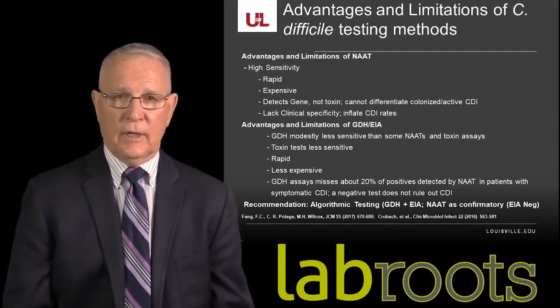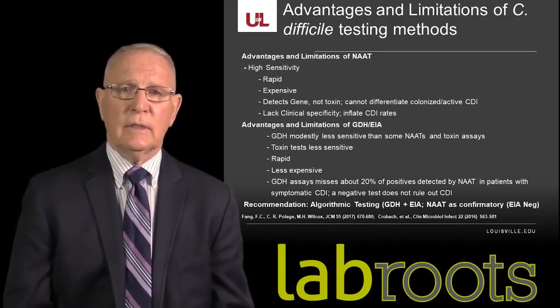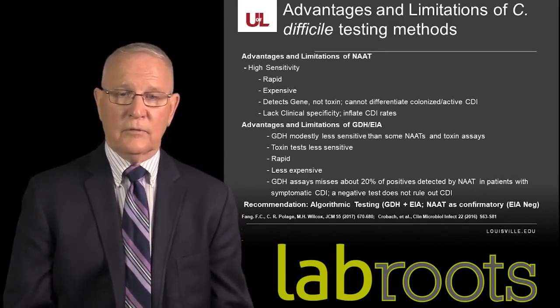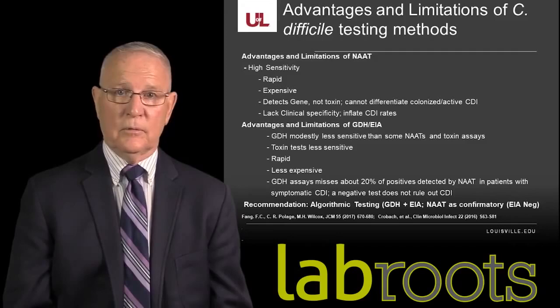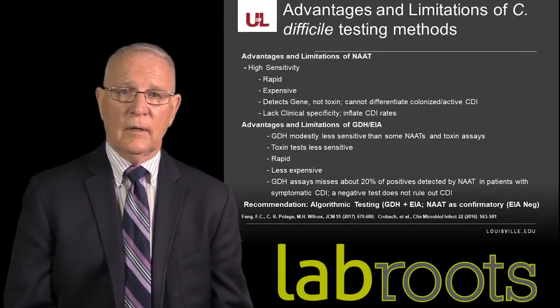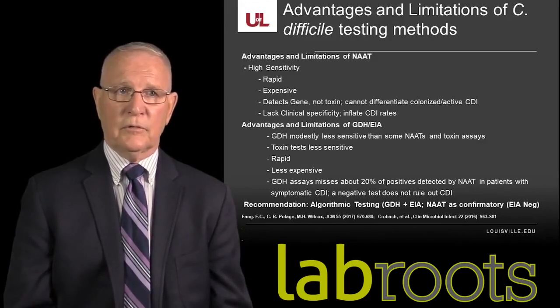On the positive side, in addition to being highly sensitive, molecular assays used for C. difficile testing may promote better infection control measures. They may promote better utilization of antibiotics, for example, withholding antibiotics if the test is negative, and they will have a positive influence on antimicrobial stewardship programs in general.